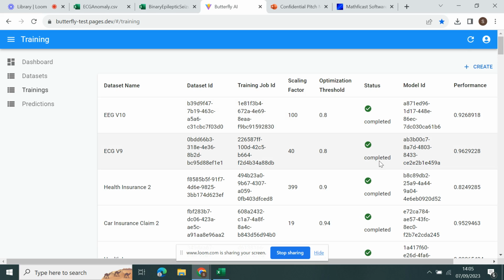So we have managed to achieve 92% accuracy of joint prediction of training data and test data. We explain on the website what this metric is within our instruction manual. And this is significant because, as you saw, we avoided weeks of research on these models and months of work to put this model into our production pipeline in order to tackle the new problem of epileptic seizure detection. Now, both problems of ECG and EEG based medical diagnosis have been handled so easily using this technology.